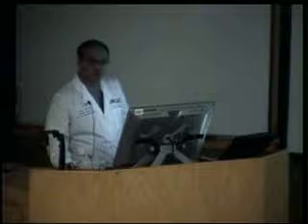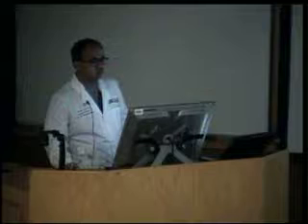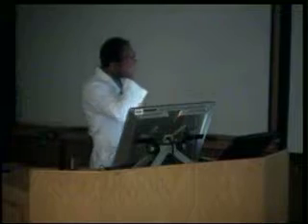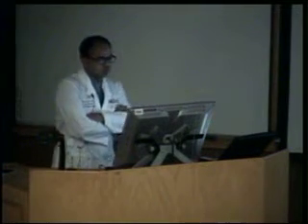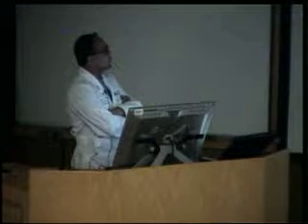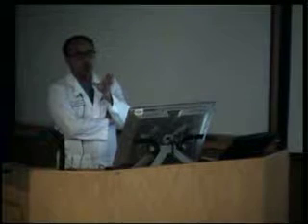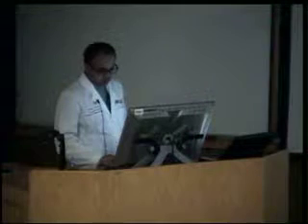Same as for an abdominal aortogram, I usually use 15 for 30, and aortic arch and abdominal aorta both use a flush catheter. If you're doing a carotid or subclavian, then it's an end hole catheter, and I usually hand inject. For the cerebral angiogram, I use full strength contrast for better imaging quality. SMA, celiac, again end hole catheter. Small vessels, go for an end hole catheter. Big vessels, aortic arch, abdominal aorta, use a flush catheter. And for the femoral segment also, an end hole catheter.